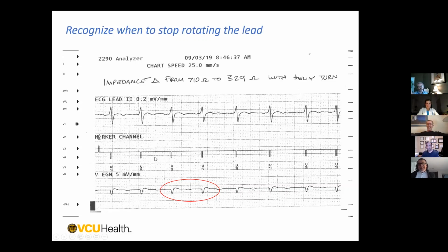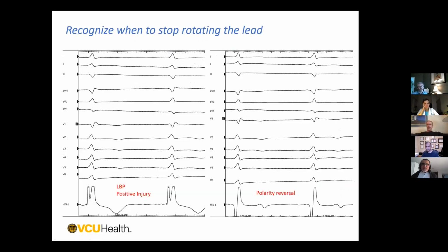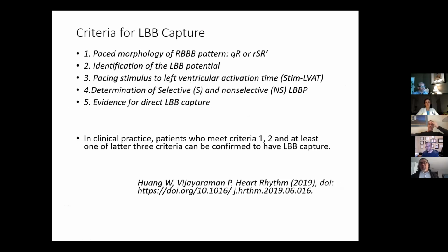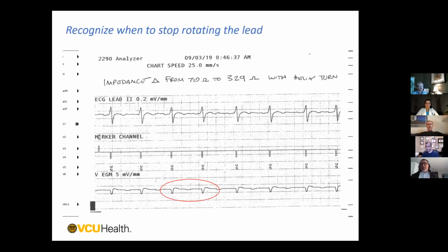So you look at the injury current as you're going across, and it's that upright injury current, and suddenly you lose the upright injury current. That's where you're usually through. But that usually means now you're there. I would say I'm close to being on the other side, but anyway. So Larry, you don't think you're in the LV?